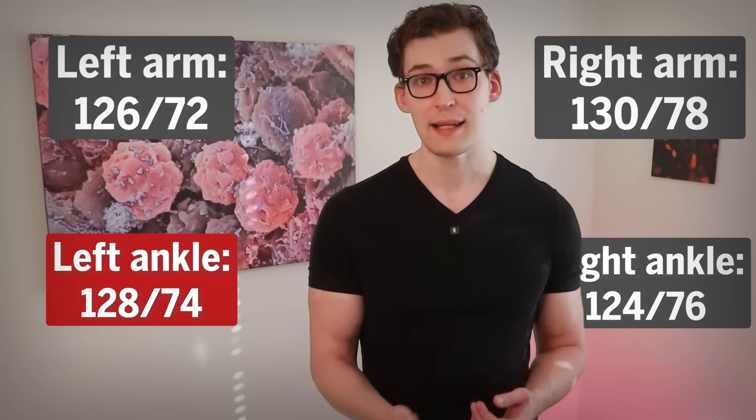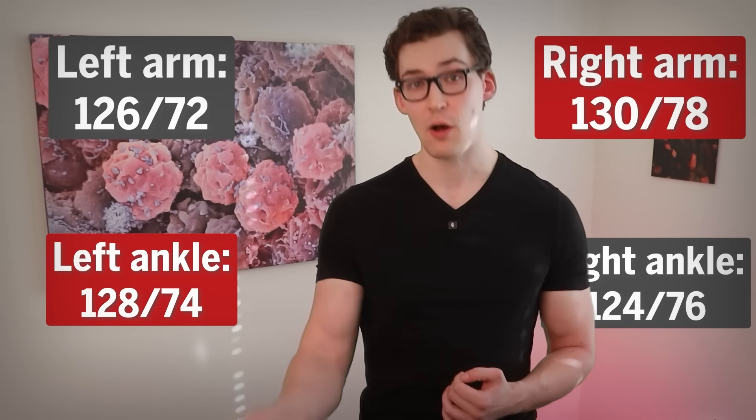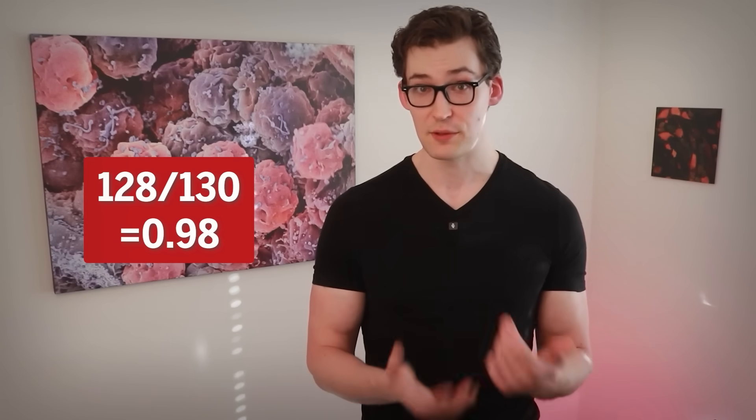You'll take your highest systolic number from your two ankle measurements and divide it by the highest systolic number from your arms. So in our example, 128 is the highest ankle number and 130 is the highest arm number. We take 128 and divide it by 130, which yields 0.98 as the result.